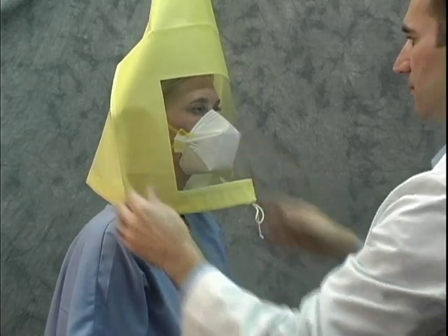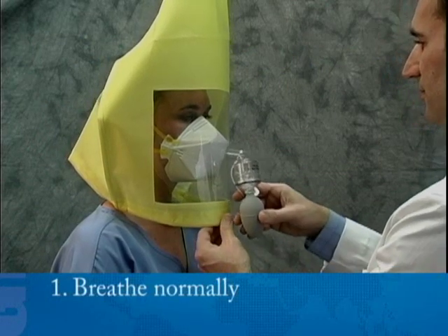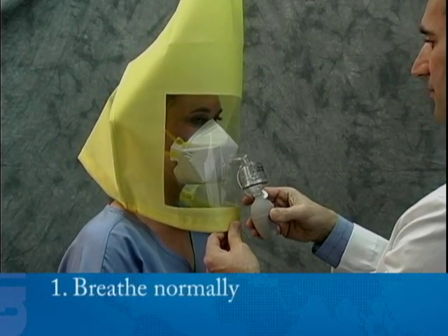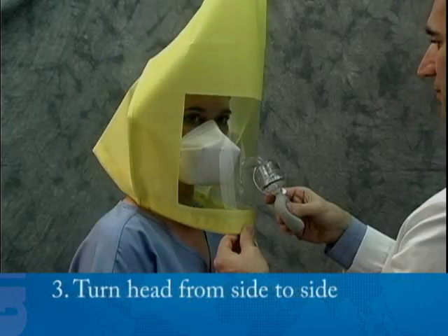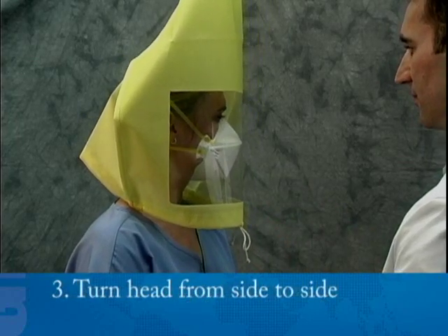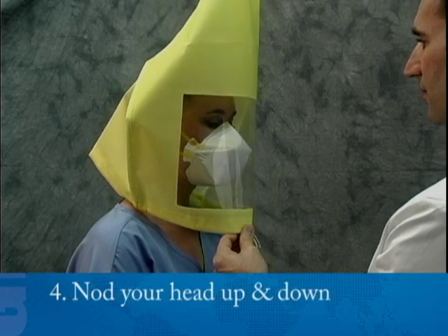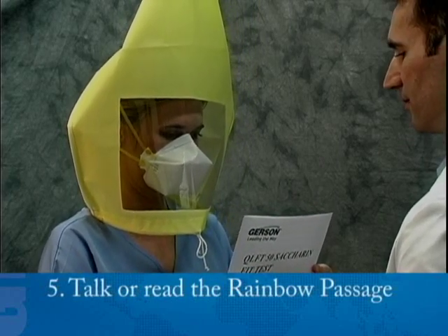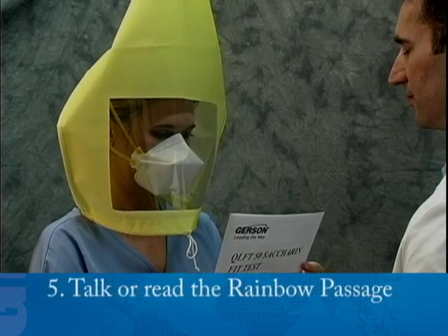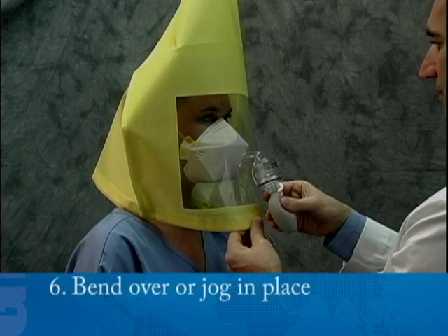Continue to breathe through your mouth during the entire test. Perform the following exercises for sixty seconds each as directed by your instructor: number one, breathe normally; number two, breathe deeply and regularly; number three, turn your head from side to side, stopping for a breath at each side; number four, nod your head up and down, holding at each position for one or two breaths; number five, talk — read the rainbow passage slowly and out loud.